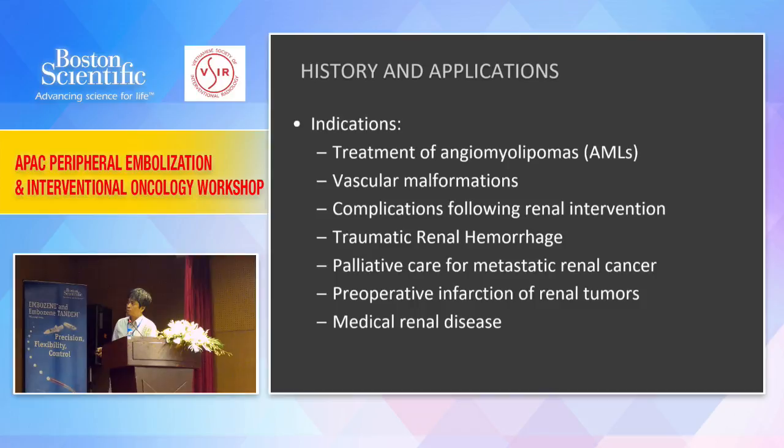And now with more renal interventions, the complications increase. So we receive very often cases where the patient comes to the radiology department after a percutaneous or surgical intervention. And in that case, there's also the indication to embolize the renal artery to stop the bleeding. And in some big hospitals, as you see, there's a lot of trauma, including renal trauma. And embolization is also a conservative method applied more and more in that hospital.